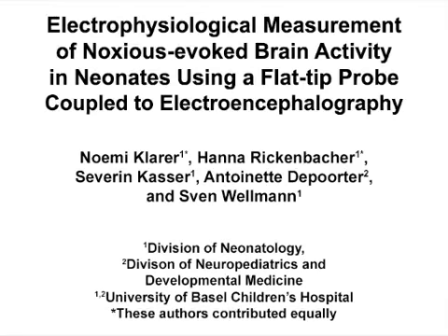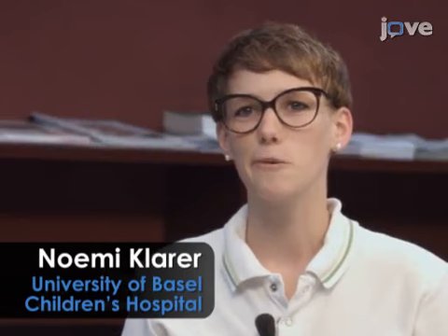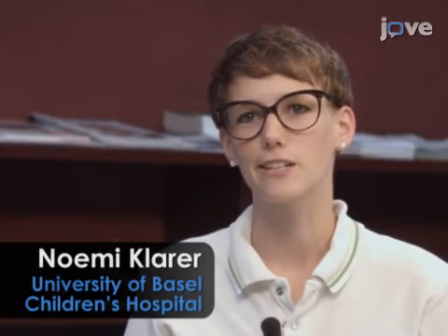The overall goal of this electrophysiological measurement is to objectively assess nociception in newborn infants. This method can help answer key questions in the neonatal field, such as how nonverbal patients perceive pain and how it differs in response to different conditions. The main advantage of this technique is that it can be used in neonates born at term or late preterm, starting at 34 weeks of gestational age.